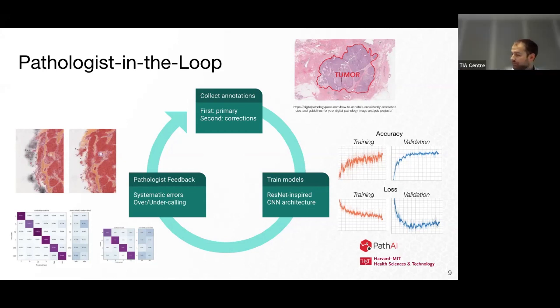Okay, makes sense. But still, I'm a bit confused. But it has been done on all the slides, like on whole slide level processes. So we produce the heat maps on every single slide, but the pathologist doesn't look at every slide.